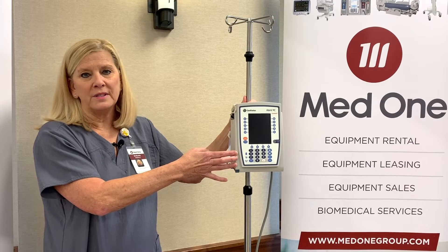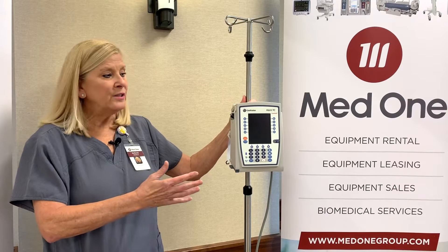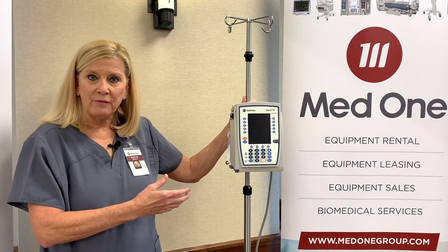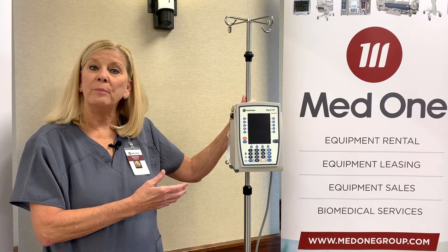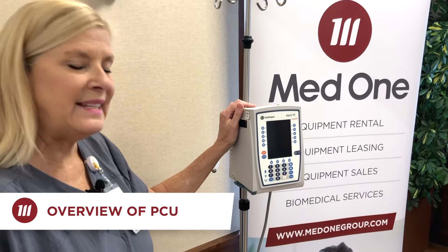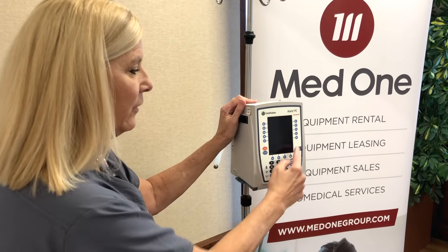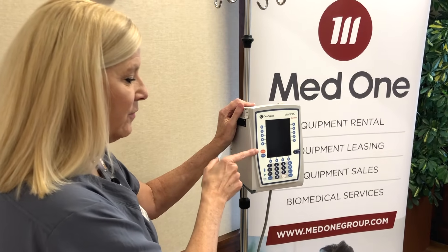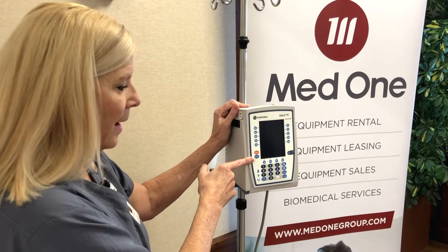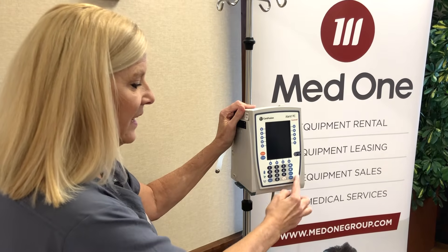A lot of nurses like to call this the brain, because without it, nothing works. The PCU is designed much like an ATM interface. You see arrow keys that surround the screen, a very large color screen, your silence button and your options, your system on button, and just below is your numeric keypad.